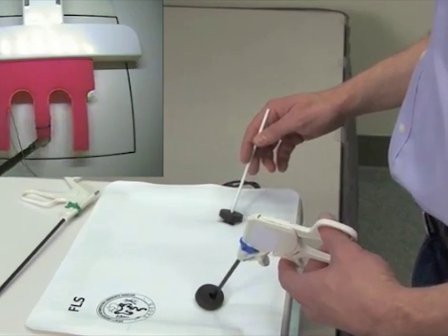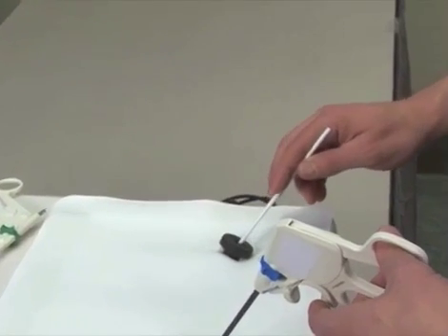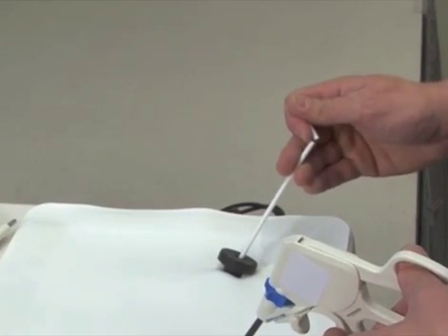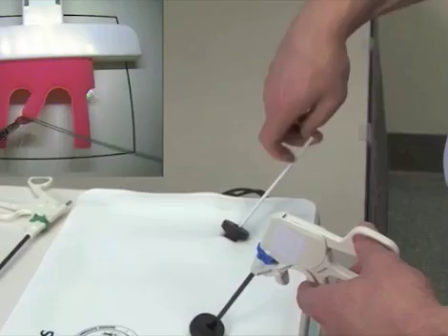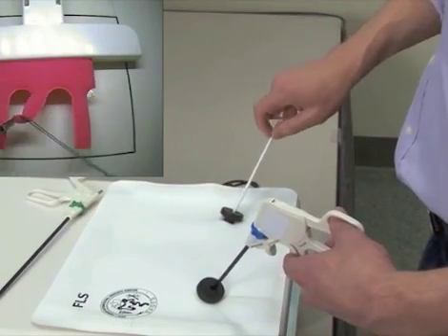Firmly grasp the multi-use ligating loop at the end opposite the loop. Break the tube at the scored line. The multi-use ligating loop is now ready for up to ten uses.